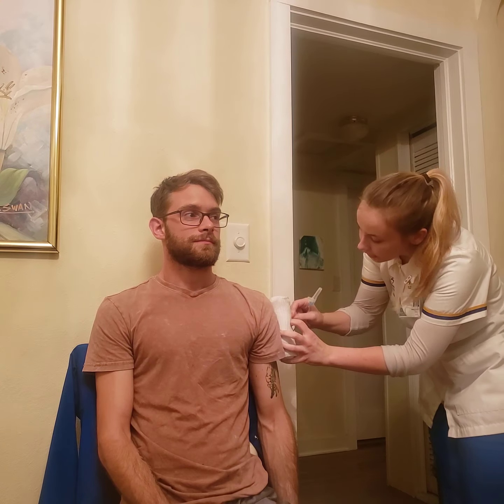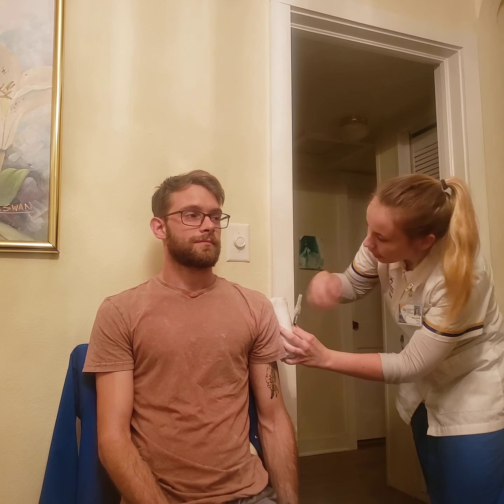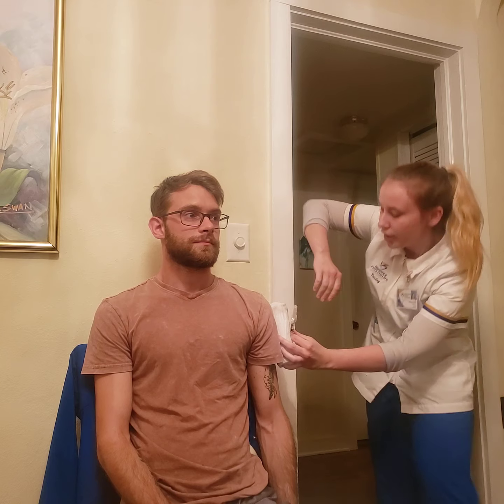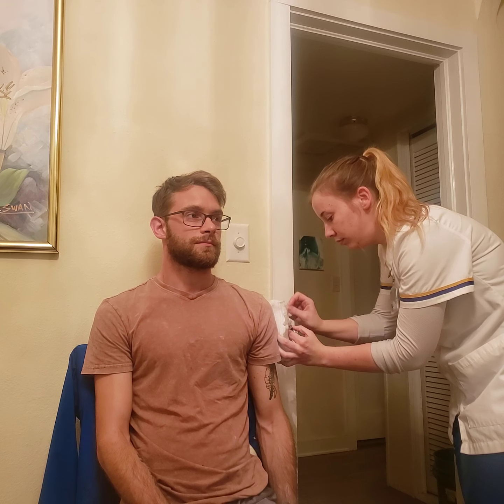So I'm gonna go ahead and clean the injection site. Like I said, I'm gonna find the bony prominence here and go down 2 finger widths and create a triangle, and that's gonna be my injection site. I'm gonna clean my injection site here.